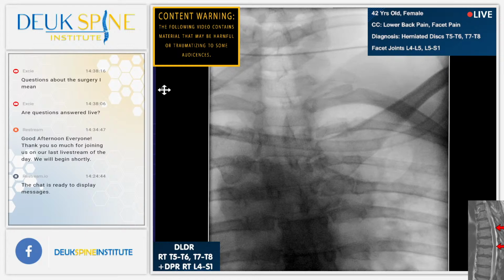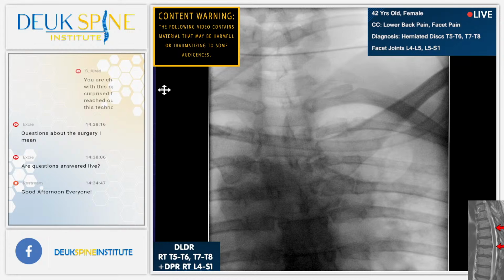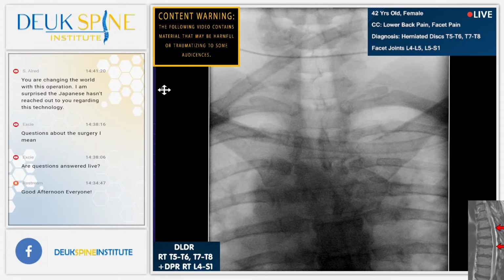I'm not seeing a clear T1 rib. Can you bring the fluoro a little bit to you? Shot. I don't mind if I see the rib on either side. What is that right there? Is that the ET tube? No, what is that structure there? Not that. The big tube-like thing. Oh, no, it's not an ET tube. Get that out of the way, please. That's confusing everything. Let's take a look again.